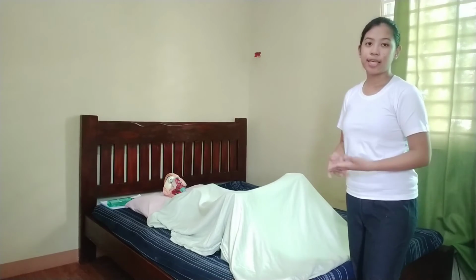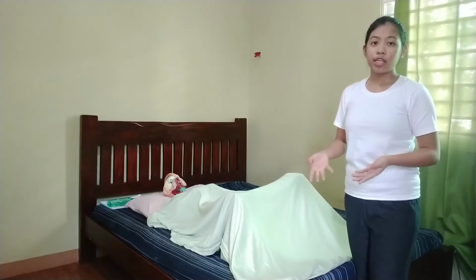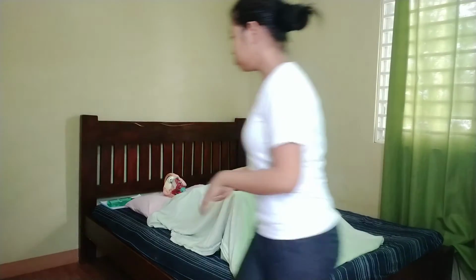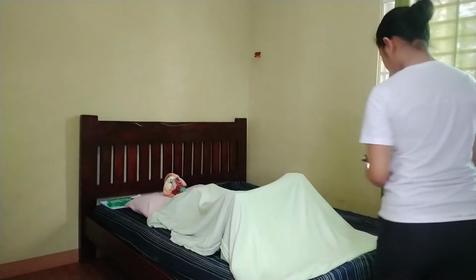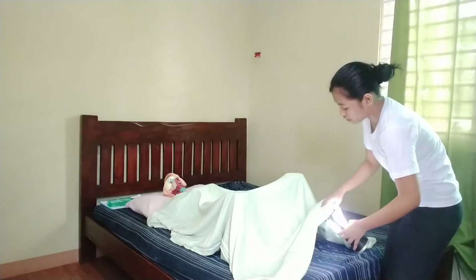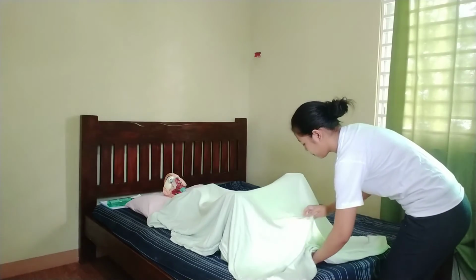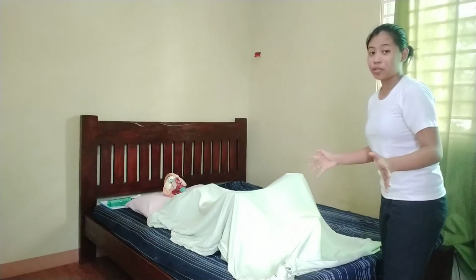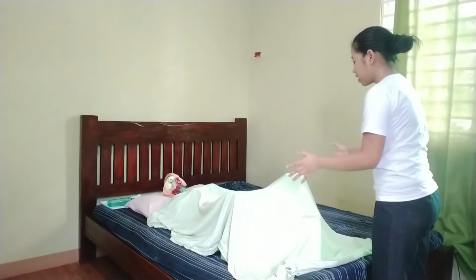I will now put the Perilite, or the heat lamp, under the blanket, about 18 to 24 inches away from the perineal area to avoid burning the patient. So ma'am, I will put the Perilite under your blanket. We will instruct the patient not to change position and not to touch the lamp during the procedure. So ma'am, lie still and do not touch the lamp.